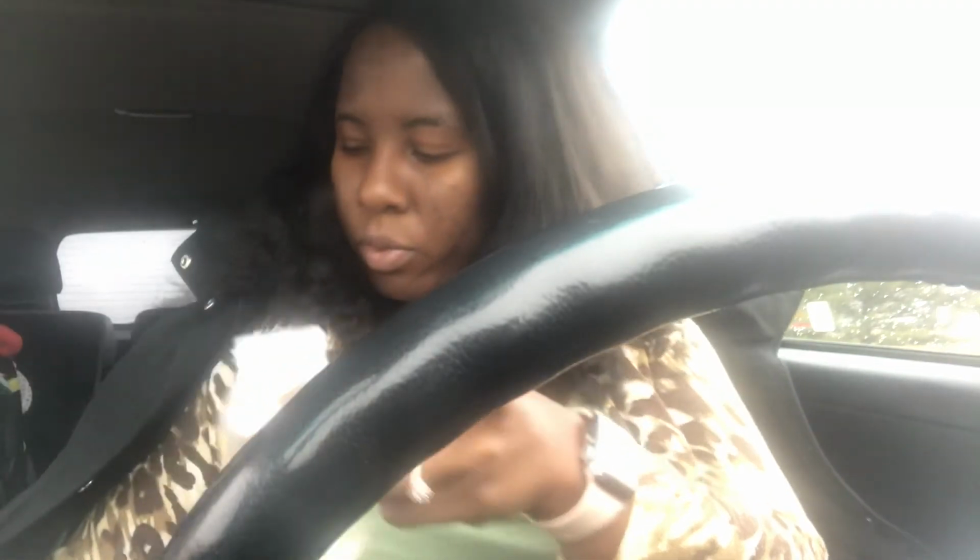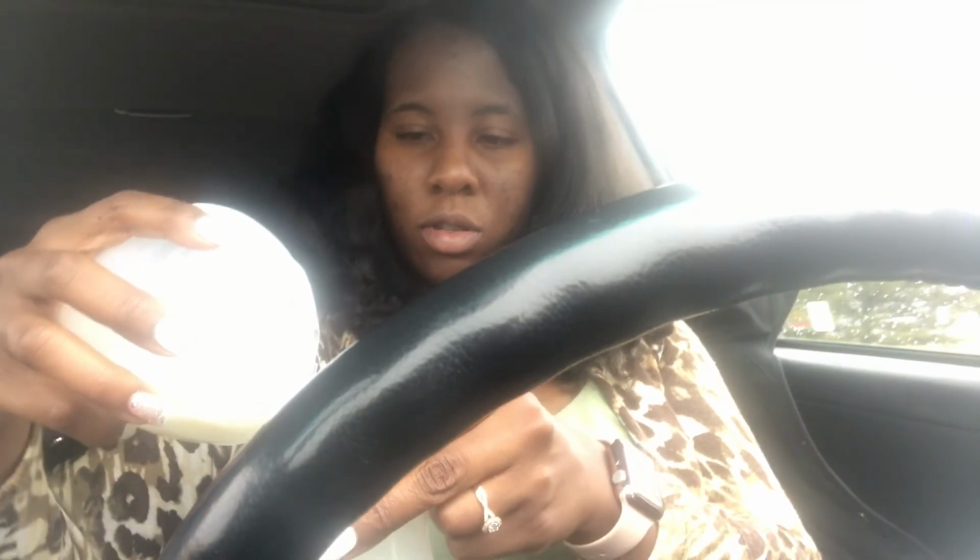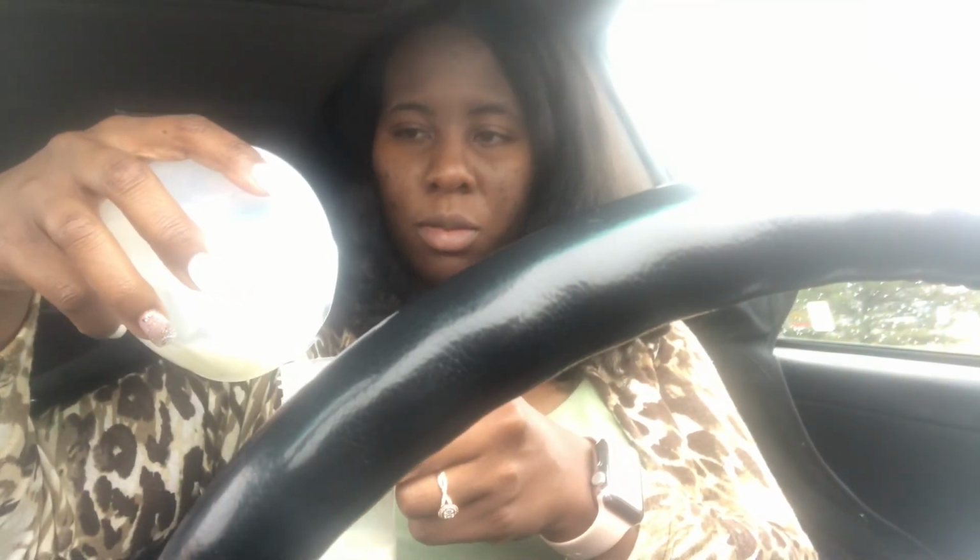And I like to just tip it sideways from the flange to just get those extra few drops that didn't make it to the collection cup. Do that with the second one. Just dump it in the Medela bottle. Extra couple drops.